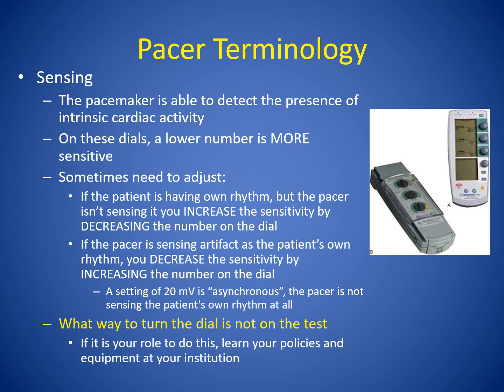If there is a 10-foot high fence, or a 10 millivolt sensitivity, the pacer may not see what the ventricle is doing. The fence needs to be lowered. So changing the sensitivity from 10 millivolts to 2 millivolts is like lowering the fence from 10 foot to 2 foot. However, the pacemaker may then see more than it needs to, such as artifact, and it doesn't pace when it should. So the size of the fence needs to be just right.